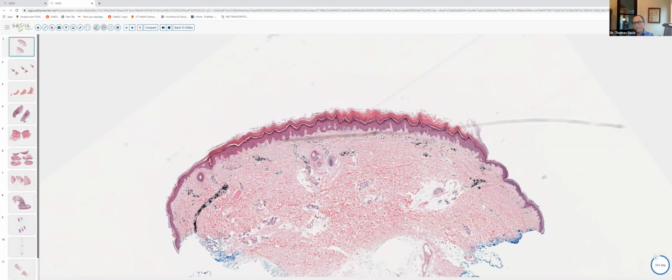The other thing to note too, I just happened to notice it at this time. Do you see the way that there are rips, vertical rips in the tissue? That's particularly common with foreign bodies. When the tissue gets mounted onto the chuck, onto the microtome, when the blade hits the foreign material, it tends to rip and drag through the dermis, producing these rips in the tissue. So rips in the tissue can be a clue to foreign body reaction.